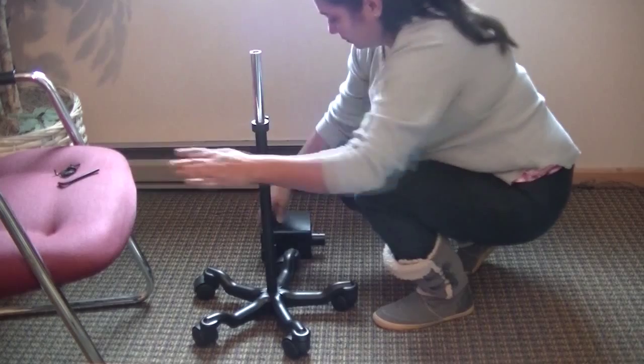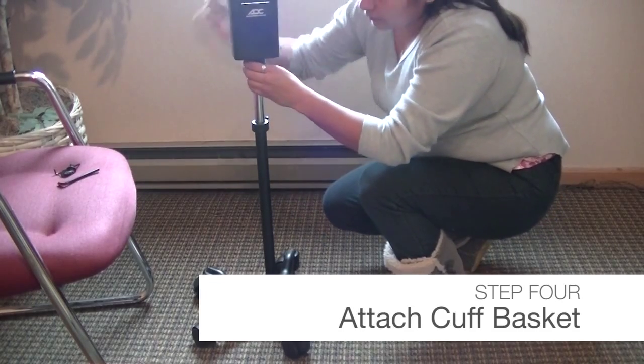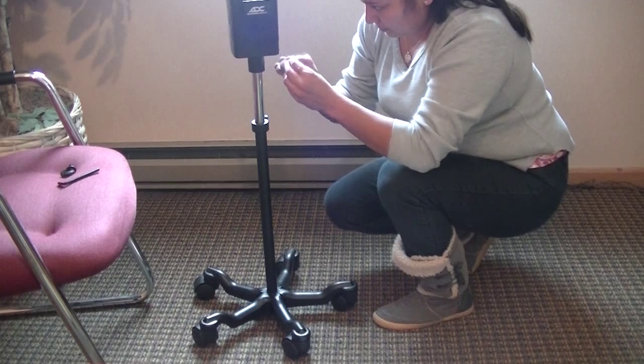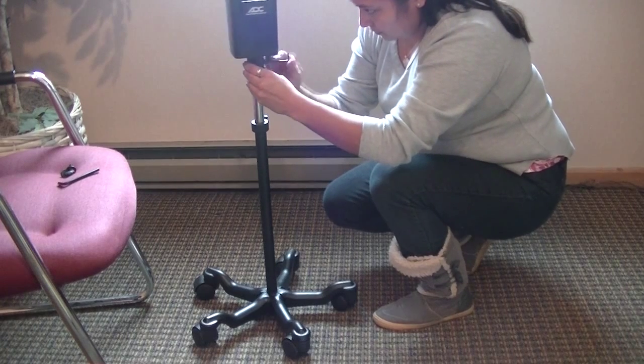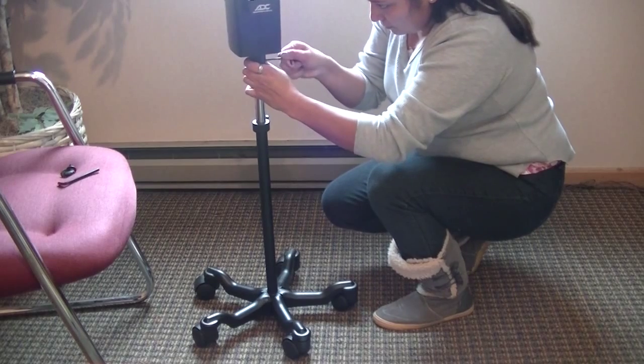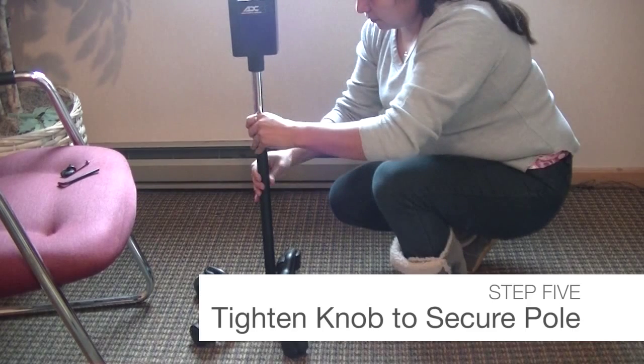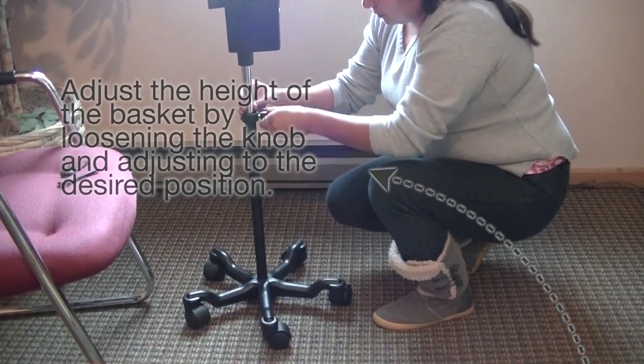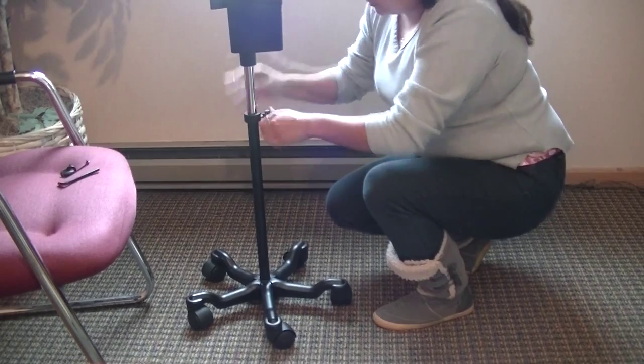On the cuff basket, loosen the 3mm bolts and then attach the basket to the top of the inner pole. You can adjust the height of your 752M-02 by loosening the adjustment knob and raising or lowering the inner pole. Once you've reached the desired height, fully tighten the knob.